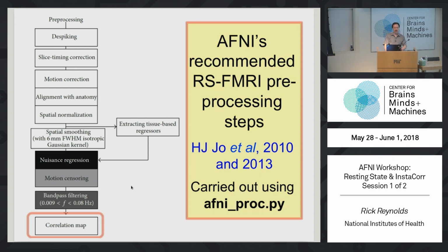We have a bunch of slides later on that I may or may not show you, but effectively, if you do something like a global signal regression, suppose you've got a correlation matrix of all these regions in the brain correlated with each other, or even all the voxels, 100,000 by 100,000, but just pretend it's smaller. Without doing anything like that, the overall correlation is very strongly positive.